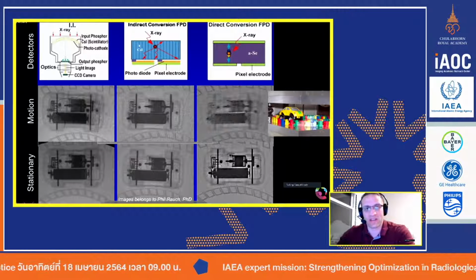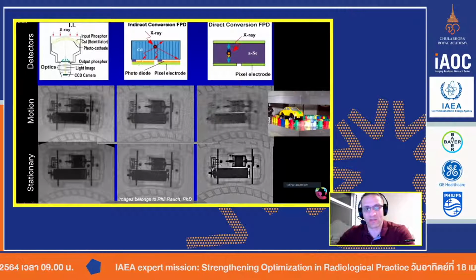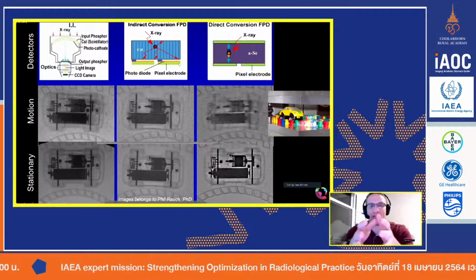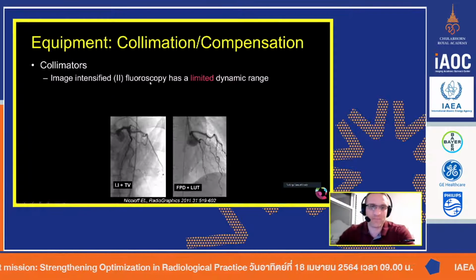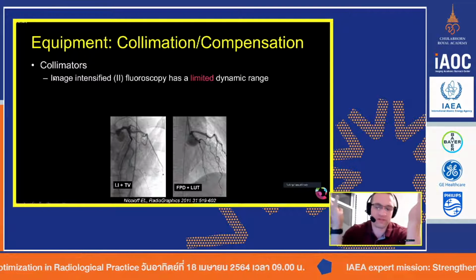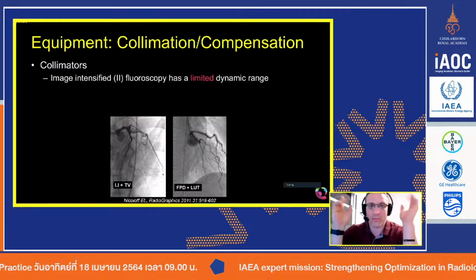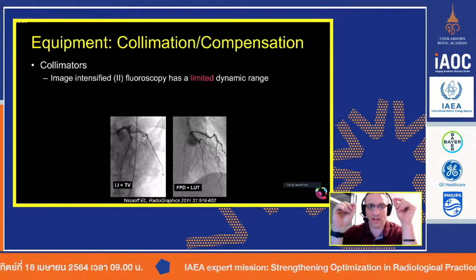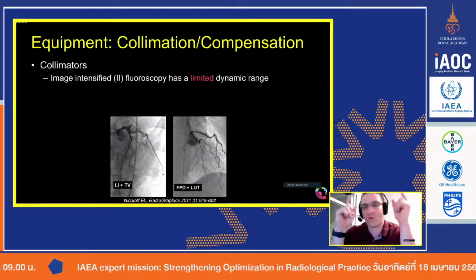Whereas on these guys, the amount of noise depends on how many of the actual detector elements you either average or bin together, or you don't average. But we'll talk about that in a moment. So those are the two things. Obviously, you just use the system you get. It's got an II on it, or it's got a flat panel. But the way we use those now depends if we have an II or a flat panel.